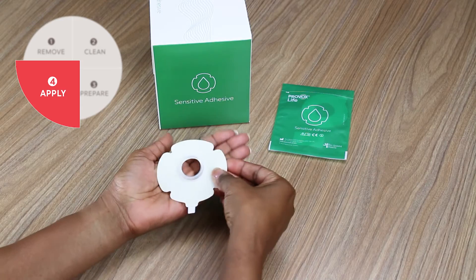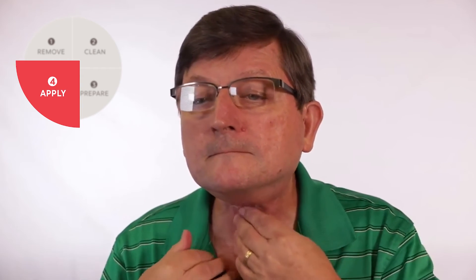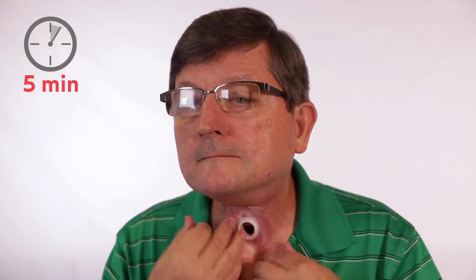Finally, apply the adhesive by aligning the bottom ring with the lower lip of the stoma. Warming the adhesive can help activate the glue and help it stick better. Place and massage the adhesive onto the skin, starting from the center and moving outward. If you have a voice prosthesis, wait at least five minutes prior to speaking to improve adhesion.